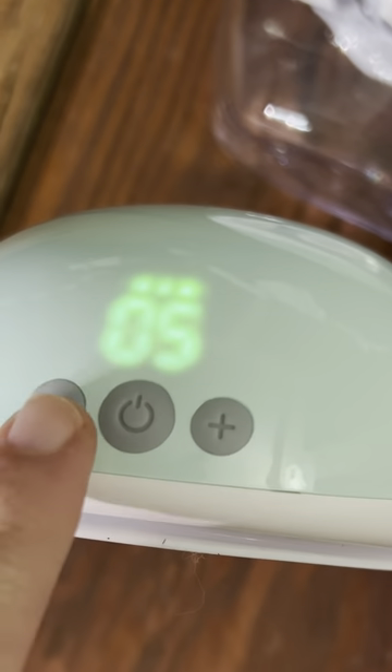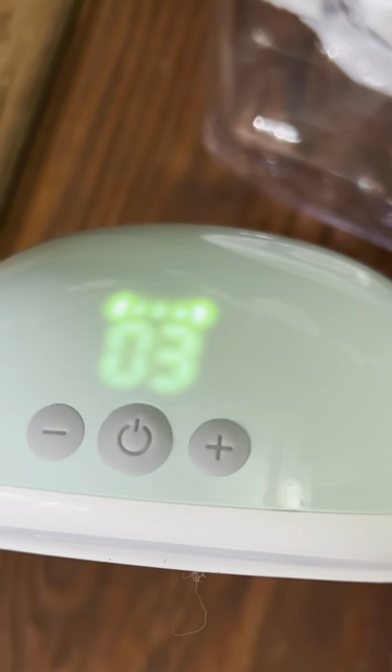Adjustment is easy as the adjustments can be found on top of the pump as well as the new Motif app. This makes the entire process almost completely hands-free. The great thing about being hands-free is then you can use your hands to multitask for things around the house, but you can also be more hands-on with your pumping.